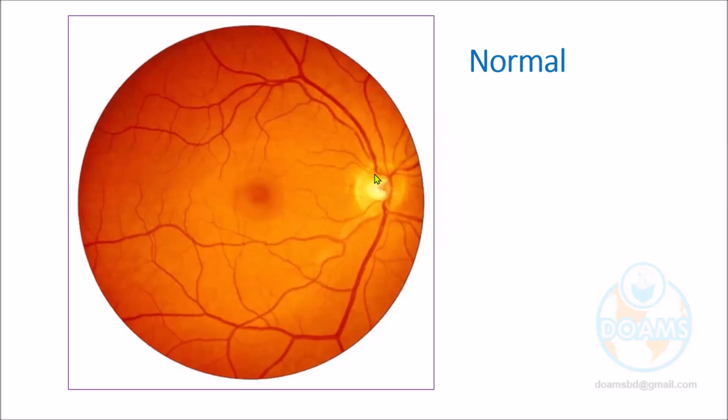No, no, this is the optic nerve head. This is the optic disc. This is the optic nerve head. And from there, at the back side, the optic nerve is formed and going back. But this is called the optic nerve head, the optic disc rather to say. But in the center, this wide area is called the optic cup. Optic cup. I will show you now one by one.